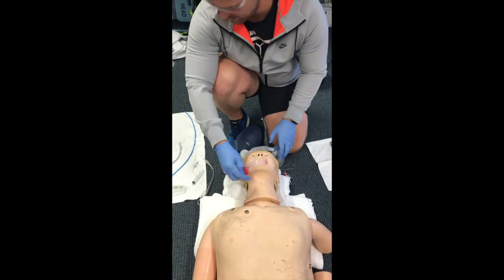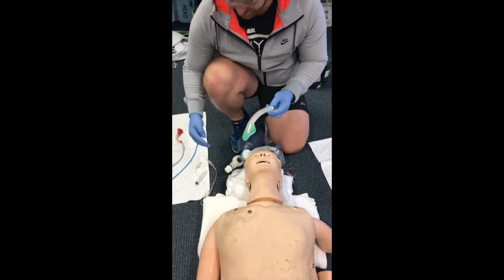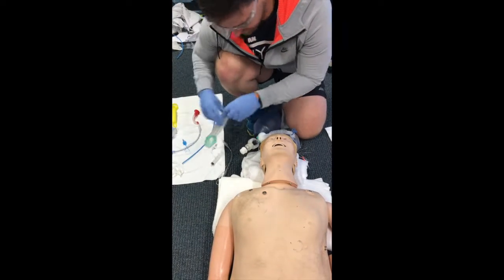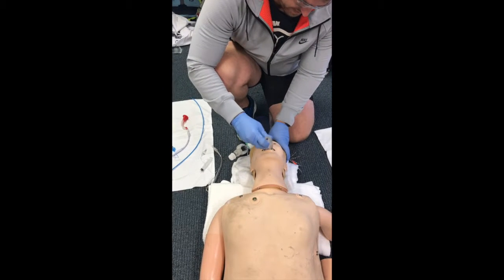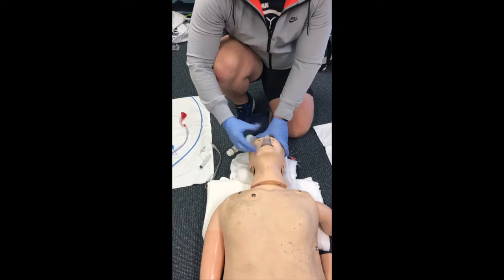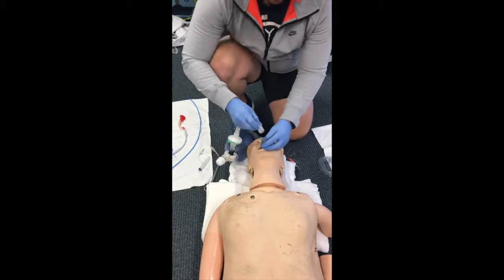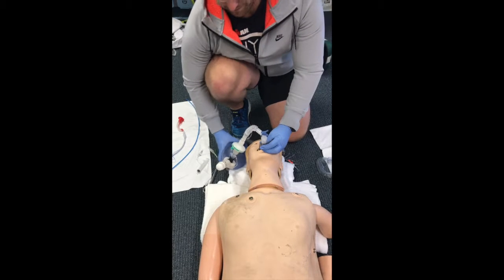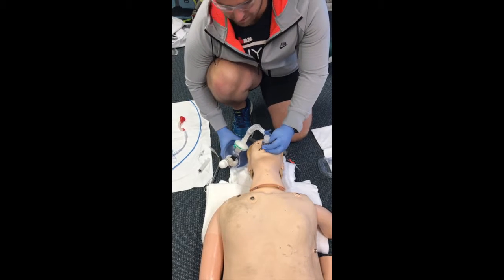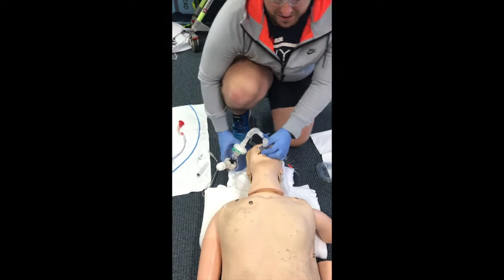I need to remove the Goodell's and get my i-gel, size 4, so appropriate size for this patient. Need to lube up the posterior aspect of the i-gel and just slide it over the back of the oropharynx, push it in, and it should rebound a little bit like so. Attach my BVM, give some ventilations, and what I'm looking for is rise and fall of the chest again, looking at my SpO2s and my end tidals.